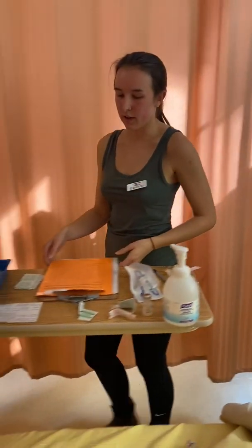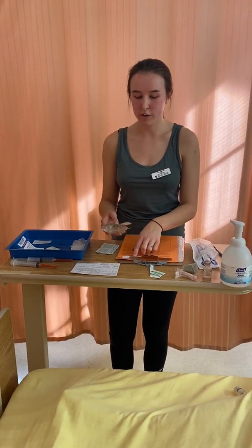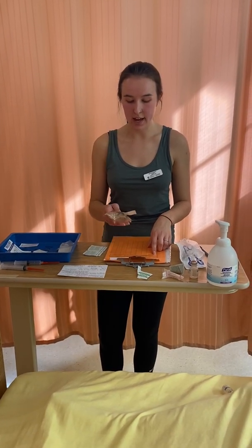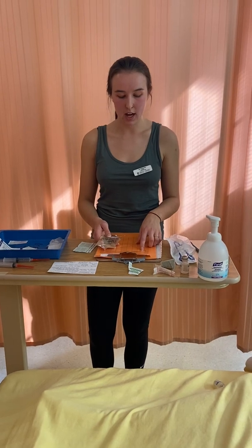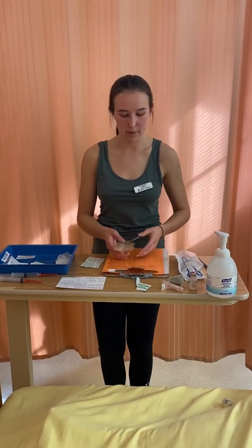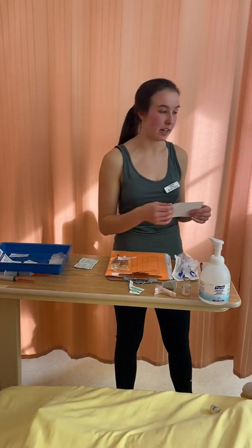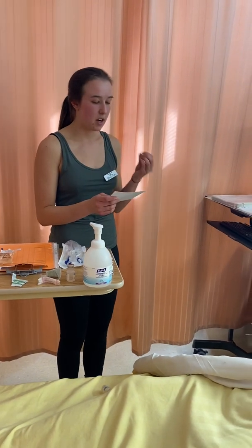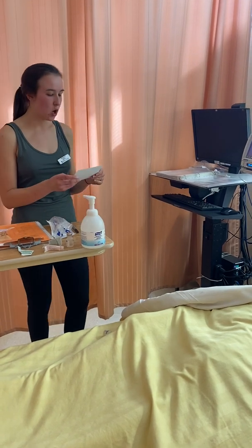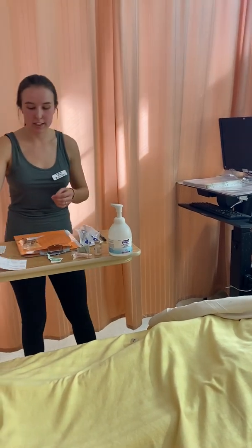Coming back over here, I'm going to complete my third check. My right patient is Fiona Friedman. My right medication is vancomycin. My right dose is 500 milligrams — I have 500 milligrams of vancomycin. The right route is IV. Right time, rate, and frequency is every 12 hours with the dose due now. I'm going to tell my patient about her medication: this is your vancomycin — it's an anti-infective because you have cellulitis from a cat scratch on your left arm. We're going to be monitoring for headache, loss of hearing, or any nausea. Please let me know if you experience any of that.